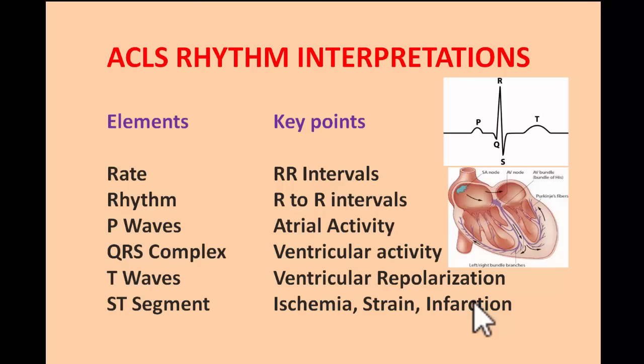So let us start off with the basic electrocardiographic building block, which is the QRS complex. It is the PQRST complex, which is representing one heartbeat.